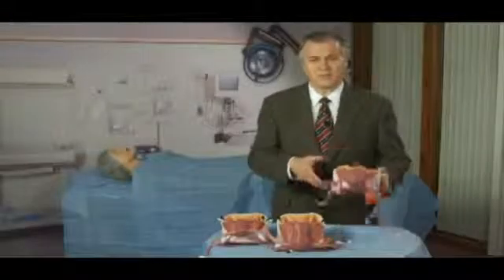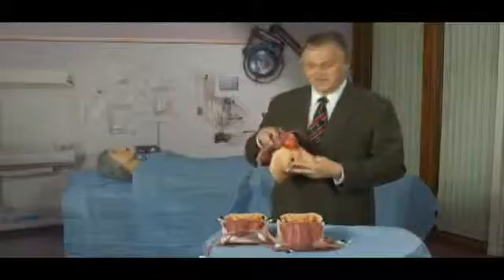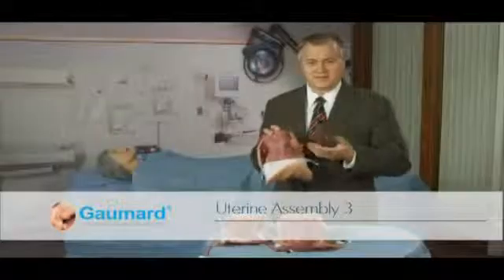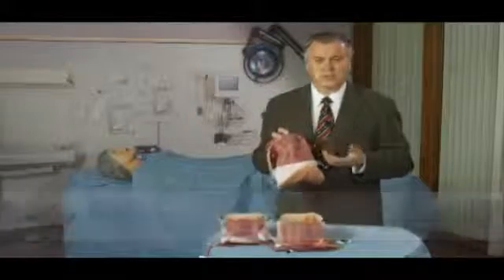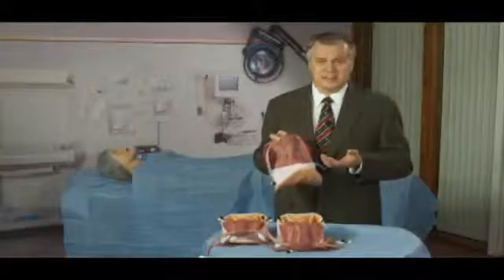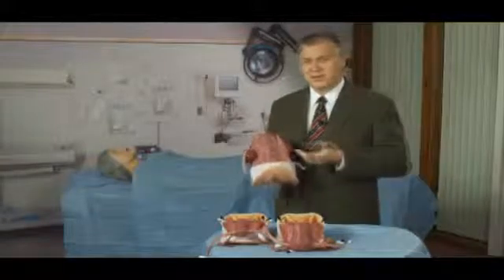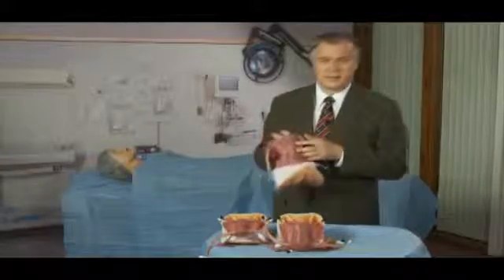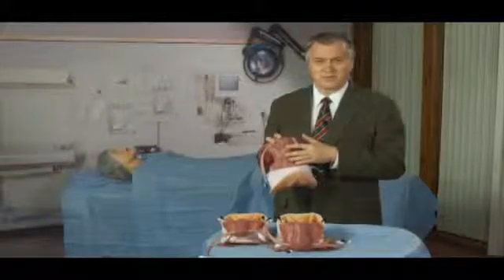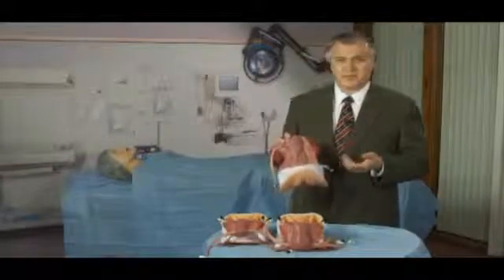Uterine assembly number 3 is the fibroid uterus. If you'll take a look, you'll notice a fibroid here. Now this is an example of an assembly in which one would need to maximize the planning purposes in order to use the assembly as many times as possible. Obviously you can't do your hysterectomy first if you wanted to teach your residents how to do a myomectomy. So you do your myomectomy first, then you might do some of the other procedures that are available.